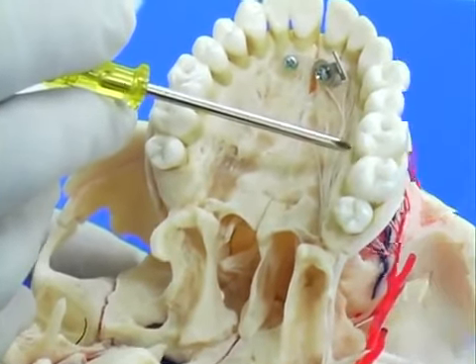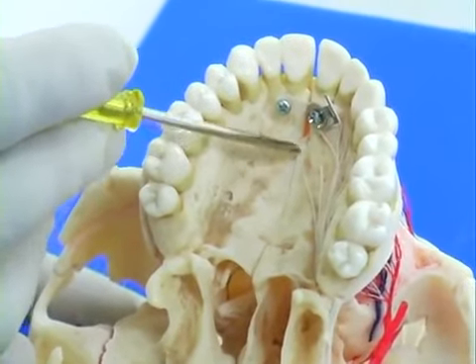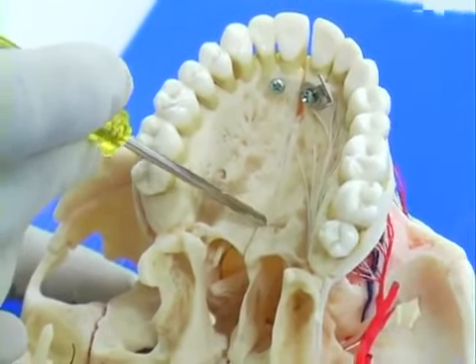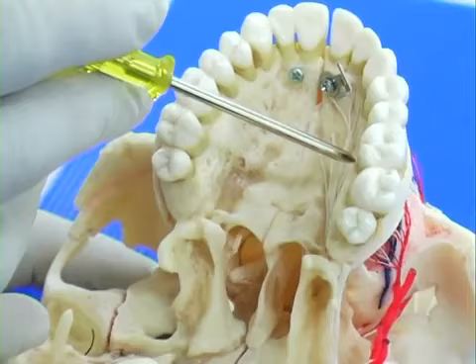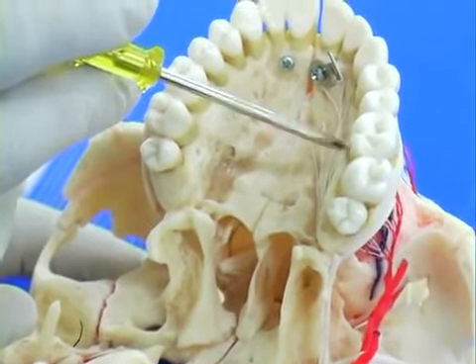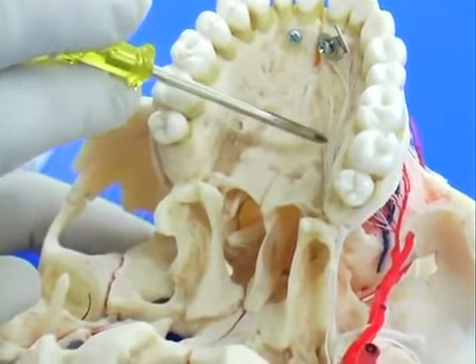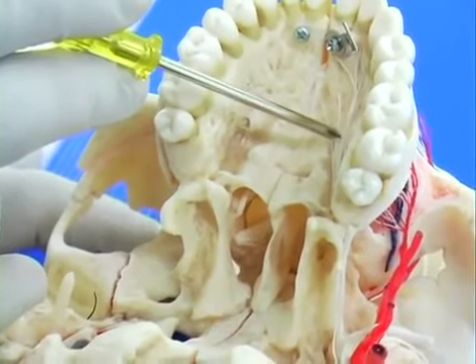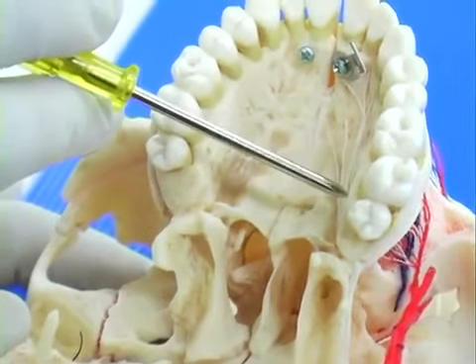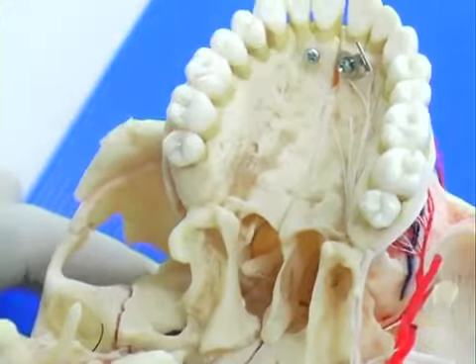Whenever you are injecting, you have to divide the palate by an imaginary line in the mid-palatal area of the patient, and again another imaginary line between the gingival crevice and the midline, and you deposit along that division. Of course, in association with the tooth, whatever has to be anesthetized.